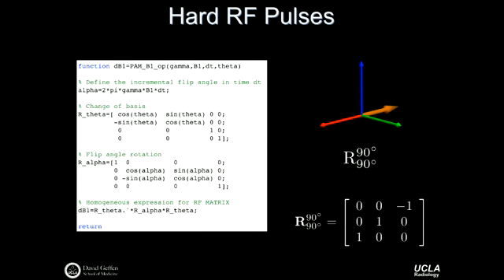Again, you'll see why that's important when we talk about relaxation maybe Monday. But for now, you have to multiply it by a 4x1 element matrix so that it was consistent in terms of its dimensionality. And then you'll have this fourth term that's kind of irrelevant, and you basically just ignore it. Again, you'll see why we need that later, but it's helpful to keep these things sort of in the same formulation, if you will. Okay?